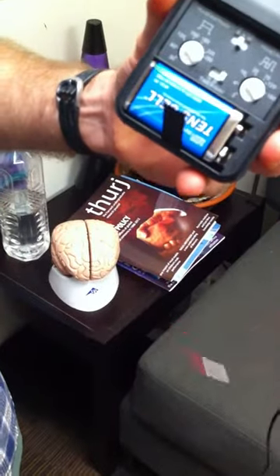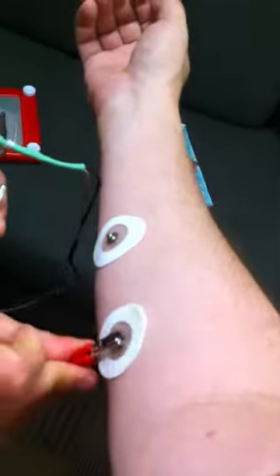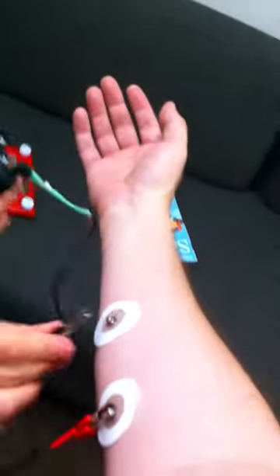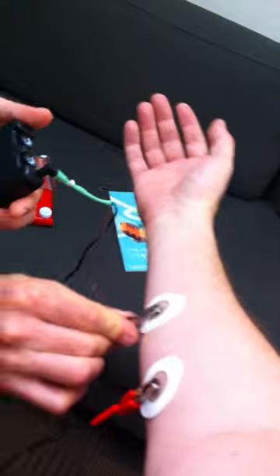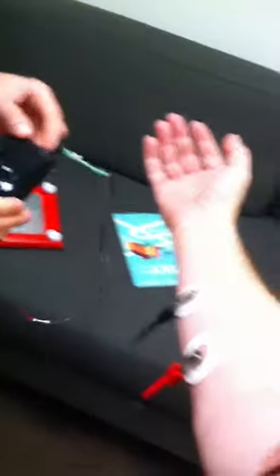Nice. So you can use it at home. You can buy this online. Alright, here's my arm. Alright, here we go.